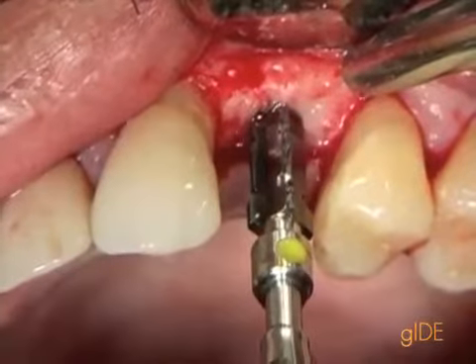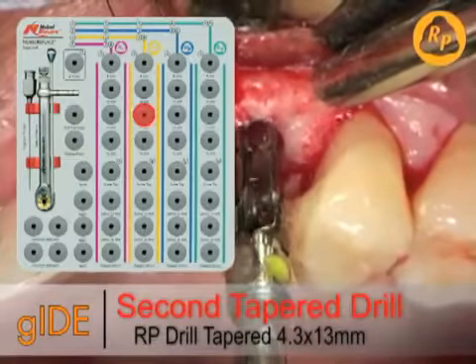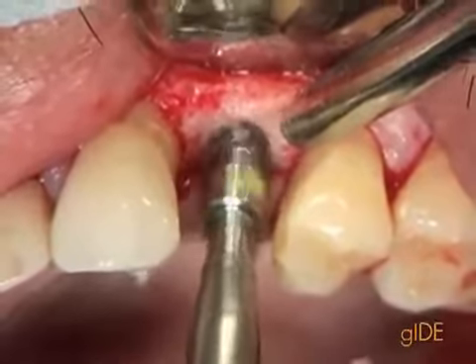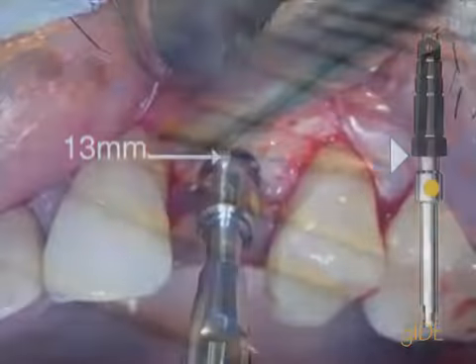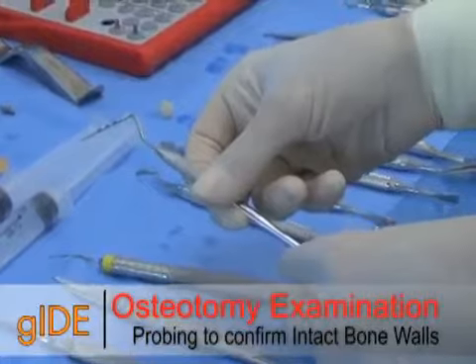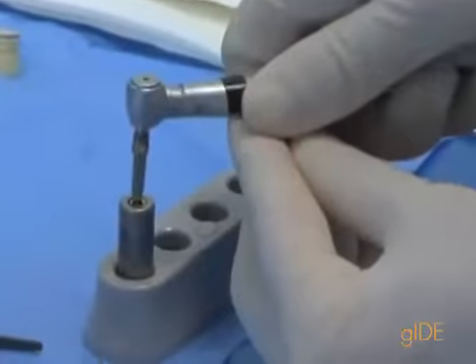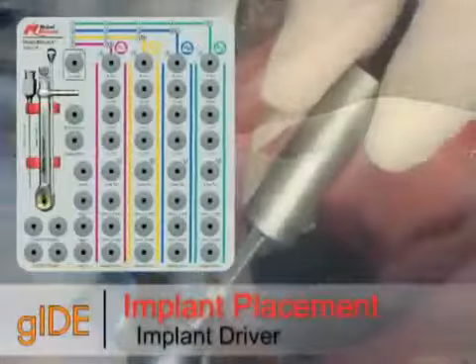for the next implant placement. The regular platform taper drill used here is a 13 millimeter, which is guided into final position, again at the crest of bone. An instrument to confirm that the bone osteotomy and the bony walls are intact and no perforations or anatomical limitations are there is used. Then the implant is picked up with a long shaft implant driver.